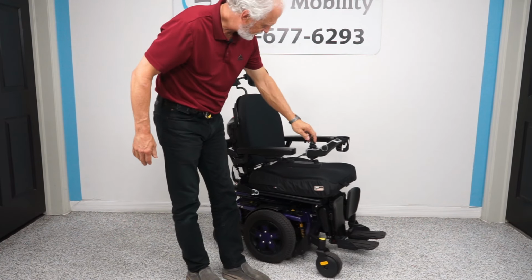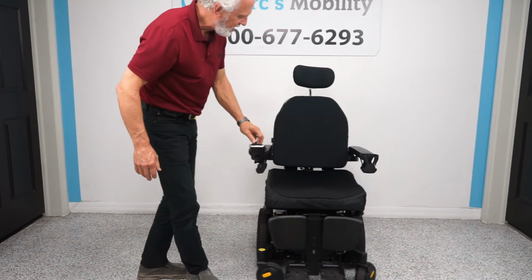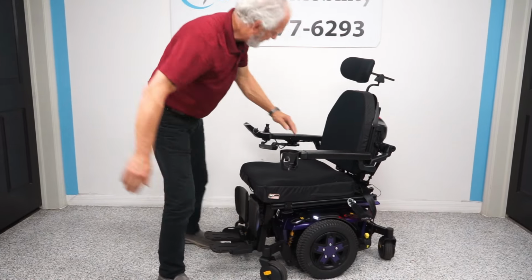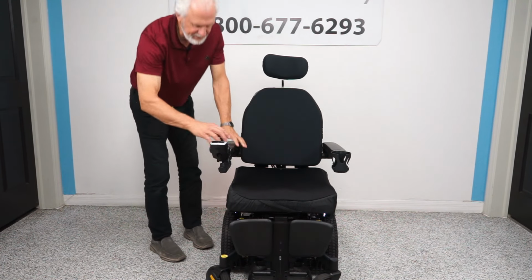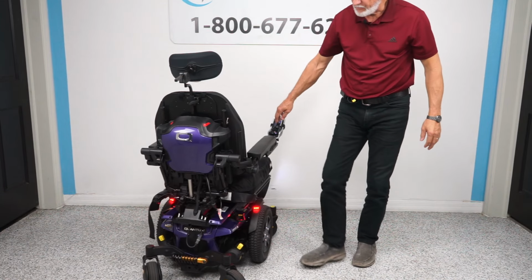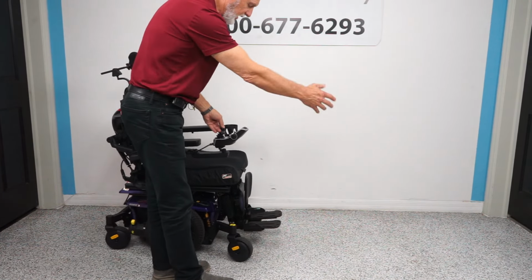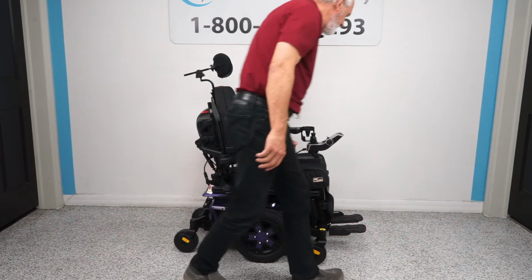You also have with this chair lights on the fenders, and the light switch is right here. So if you see this, I'm going to tap it, and you can see on the front of the chair you have headlights, and you have tail lights here on the fenders. So you have headlights and tail lights. So if you're going down the hallway at nighttime, it'll light up your whole hallway. And we're going to turn the lights off.